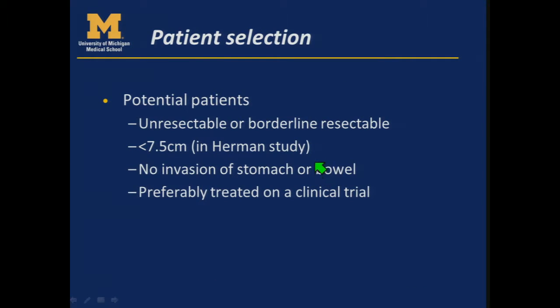So who should be or could be treated with SBRT for pancreas cancer? Well, right now, I would suggest confining it only to the unresectable and borderline resectable patients, if any at all. There are some trials that are starting up with resected patients, so post-surgery, looking at tumor bed radiation, but I wouldn't do that off trial because that definitely has much less literature, if any.